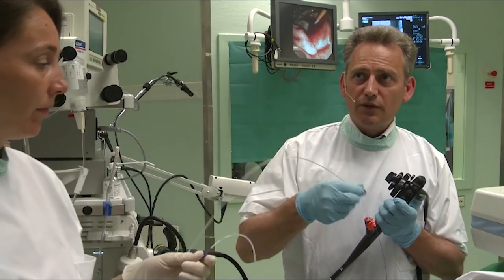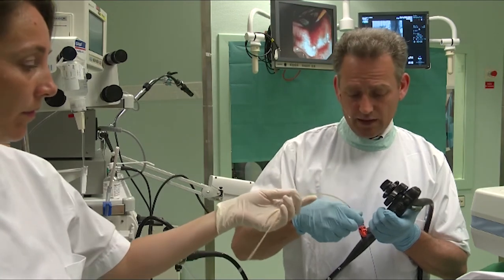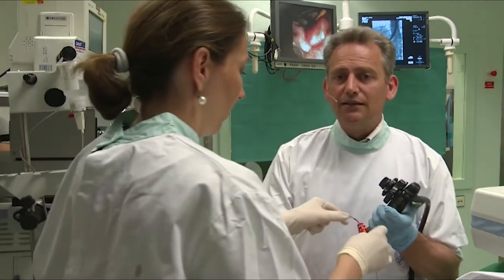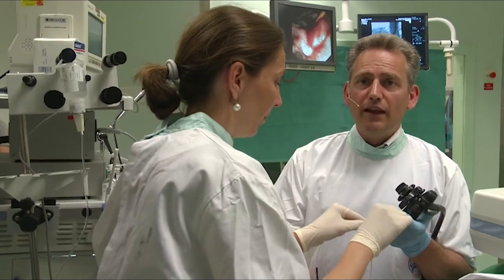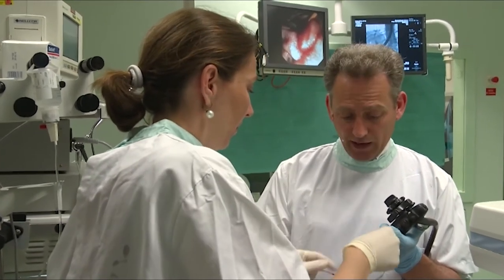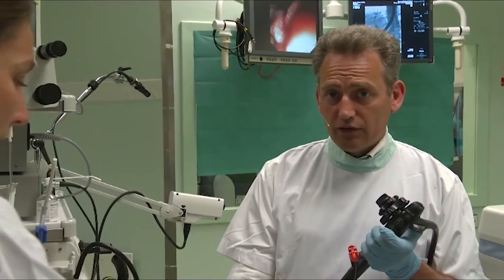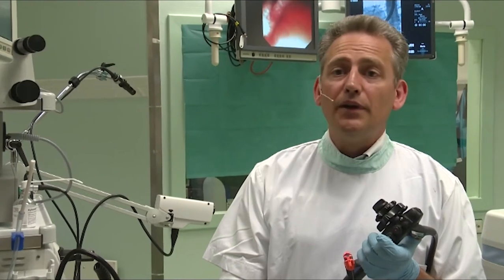And because of the presumptive diagnosis of malignancy, and because it seems irresectable at CT scan, we would preferably now drain the common bile duct with a metal stent in order to have prolonged patency, also at the time during which the patient will get chemotherapy. He will be immunologically compromised, so we need to give him the best available drainage procedure we have.